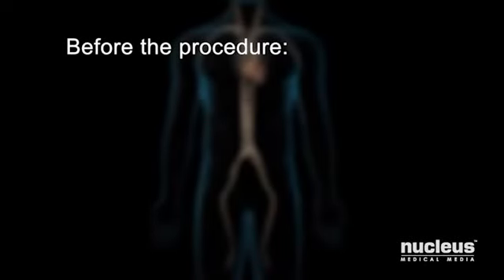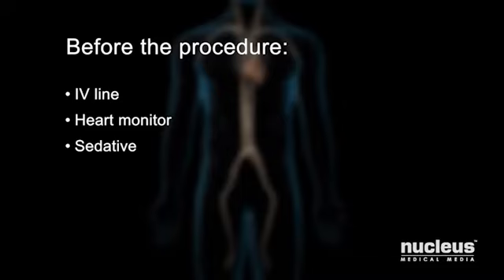At the hospital, your healthcare team will explain the treatment and get your informed consent. Then, an intravenous line will be started. You will be placed on a heart monitor, and you will be given a sedative to help you relax. Most coronary angioplasty procedures last between 30 minutes and 3 hours.